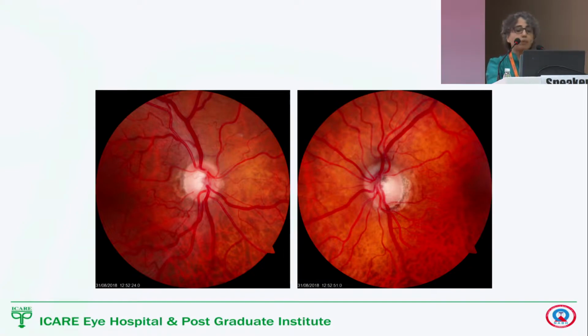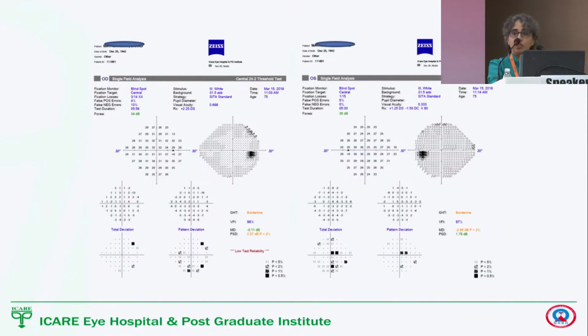Let's look at this example again. A patient who's a glaucoma suspect. We can see that the left eye nerve does look quite suspicious. You can see that the inferior rim is not as healthy. And then if we go ahead and evaluate this patient further, that's his field test. And you can see some amount of borderline scattered few defects, but nothing very typical being picked up here.